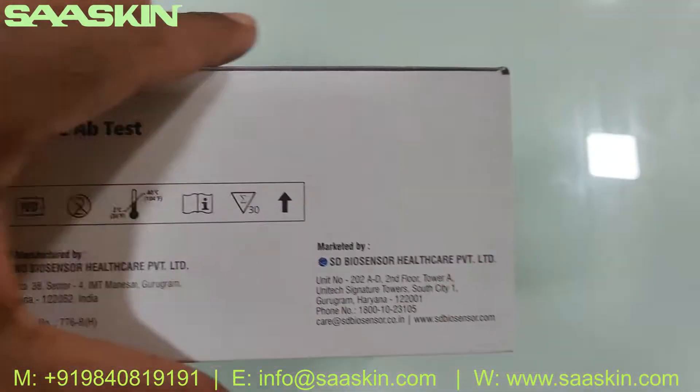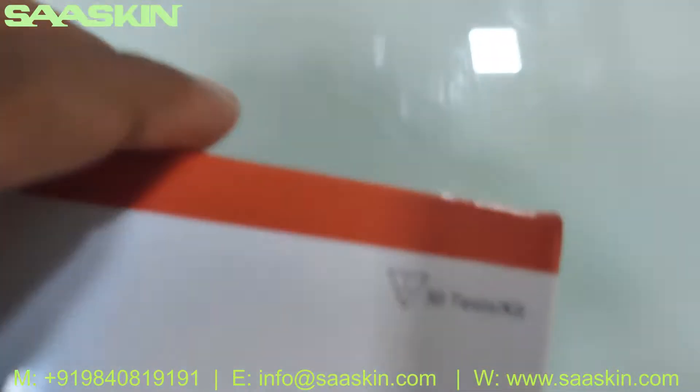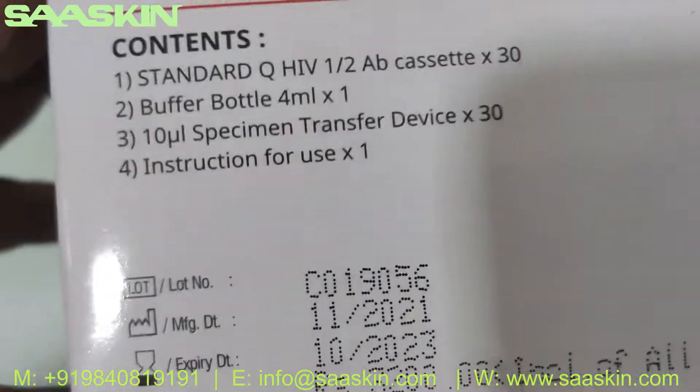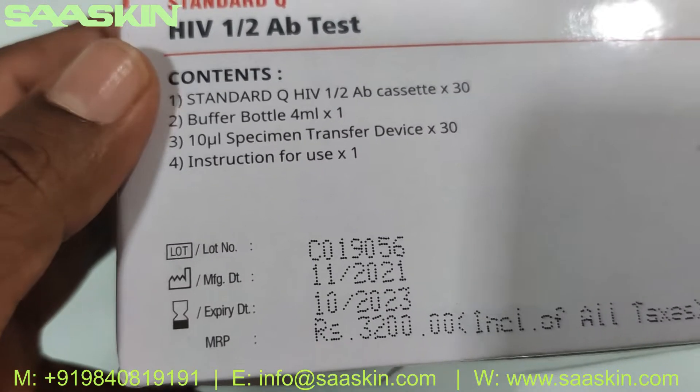Here it is. You can see it's a 30 test kit box. Inside the box, the contents are here. You can see it basically has two years of validity.